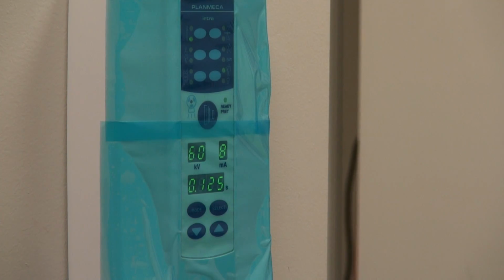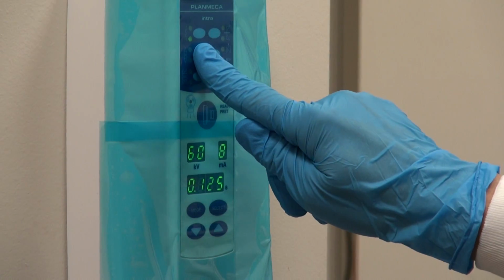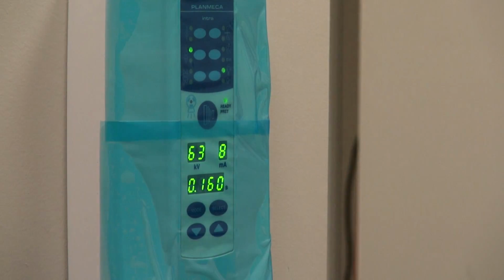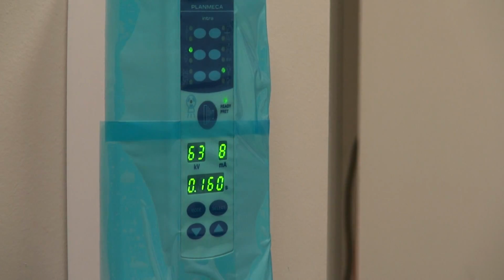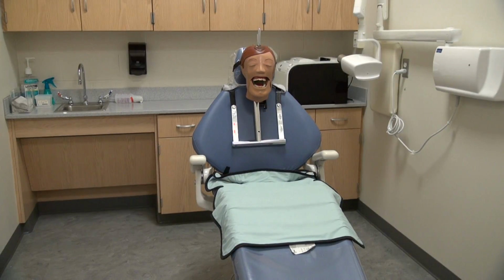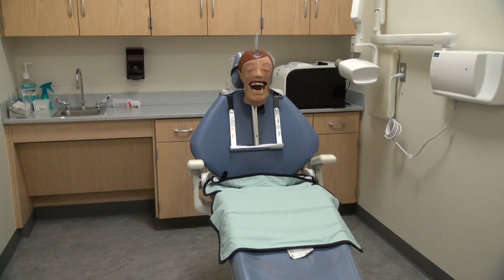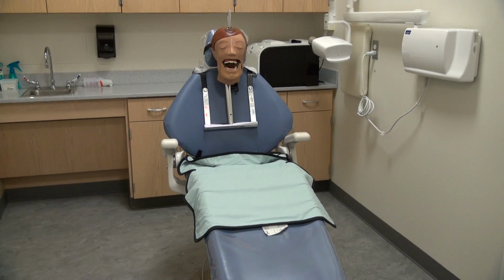We will start working in the upper right quadrant with the right maxillary premolar image. Calibrate at the control panel for the first film, illuminating the maxillary premolar periapical icon. You can see the lead apron has already been placed on the patient. Since we are using Dexter today, the apron has been laid flat on the chair to prevent any damage.